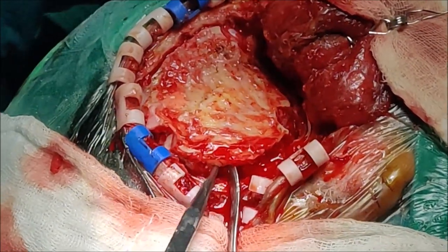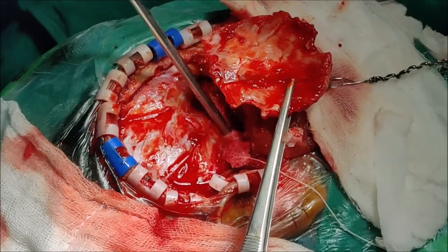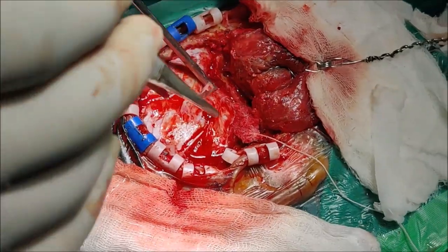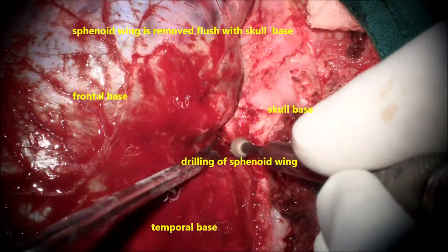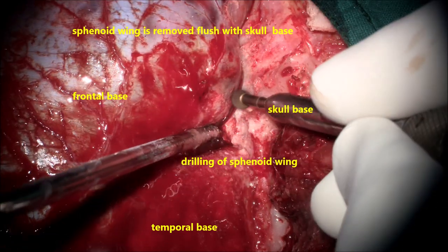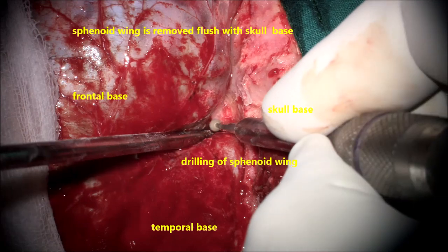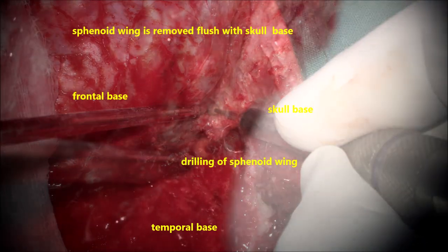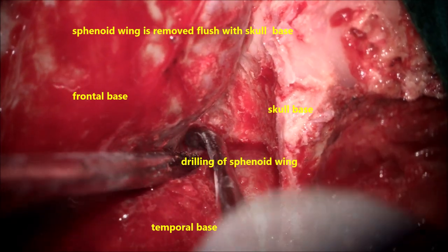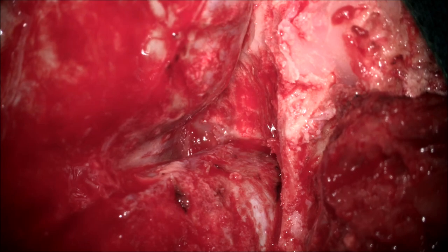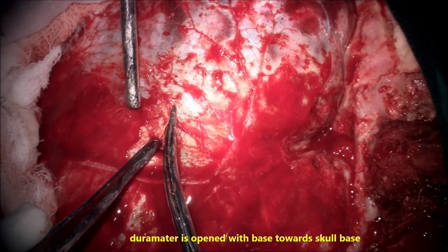The free bone flap is elevated. The dura is separated from the bone to avoid injury to the brain and avoid dural tear. The bone is taken out down to the skull base completely. The next important step is to decompress and drill the sphenoid wing completely flush with the anterior skull base. This is very important because drilling the sphenoid wing as flush as possible with the skull base reduces the need for brain retraction and avoids undue retraction of the frontal and temporal lobes.